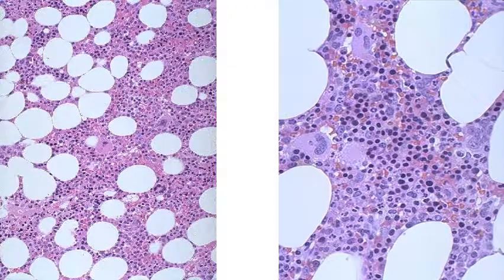To identify, white blob equals adipocyte. Then we have a very zoomed out picture. We can kind of see these big cells right here. That's going to be a megakaryocyte. White blob, adipocyte. So you notice there's a lot of adipocytes in the bone marrow.